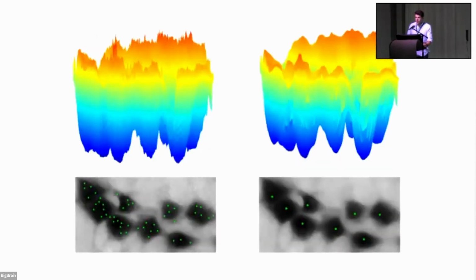I spoke with Eric and Sebastian yesterday, and the focus here is that it starts with good and as precise as possible neuronal segmentation. This is what I wanted to show you yesterday: we first smooth the image with anisotropic Perona-Malik diffusion, as the technique is called. The signal becomes much smoother and less noisy, and then it's much easier to segment out neurons. This is Nissl neuronal staining, if I missed saying this, so only neurons are visible.